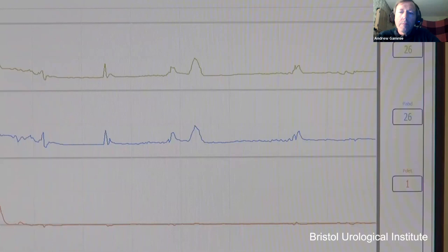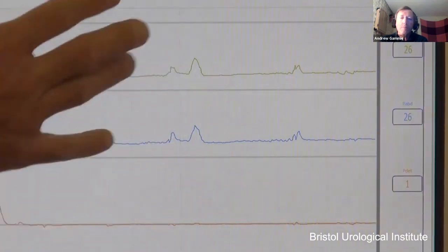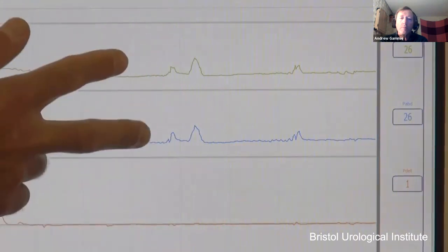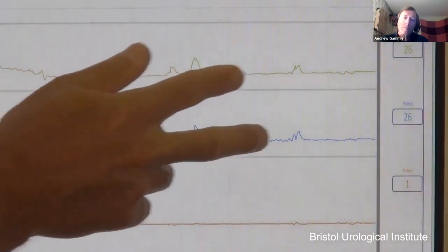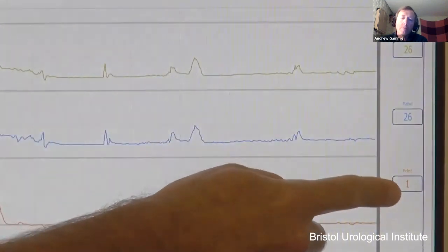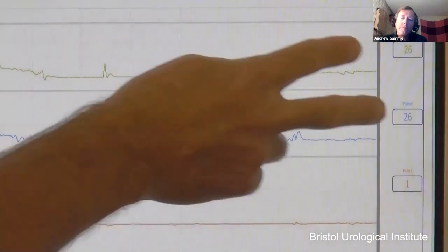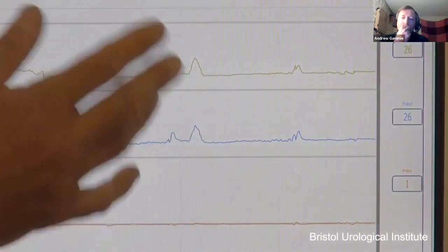Once we've checked the calibration of our system and we've zeroed to atmosphere, there are three tests for quality that we use before we start the test and at all points during the test. This trace here demonstrates them. The first one is the resting pressure. Once we've zeroed to atmosphere, the resting pressure inside the patient needs to be within standard levels. And for a seated patient, it would be around this, 26 centimeters of water on both lines, which means that your PDET is pretty near zero because the resting pressures are equal. So that resting pressure is in the normal range and that quality check is passed.